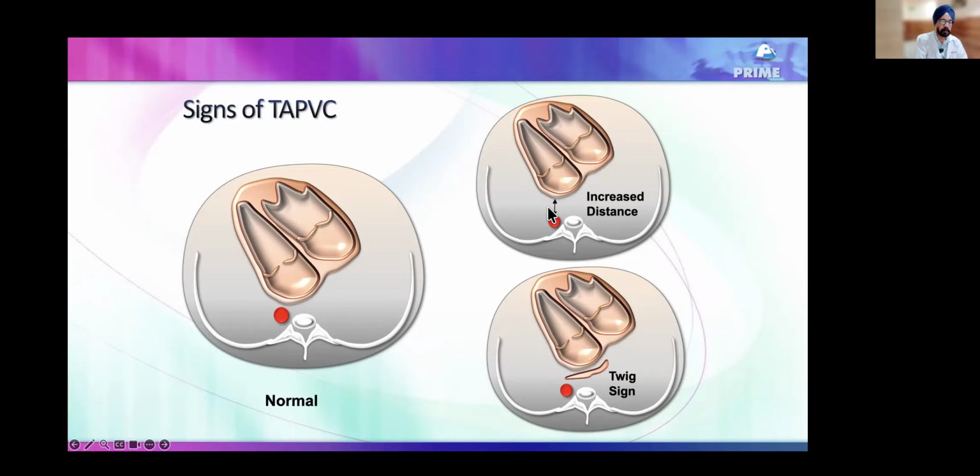So if you are able to place another aorta here, that means the distance between the aorta and the left posterior atrial wall is increased. The sensitivity and specificity of the sign is more than 95%. Very good sign, very, very reliable, provided you see two ribs like this and you are not angled.